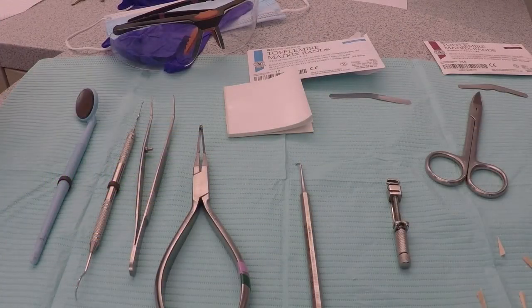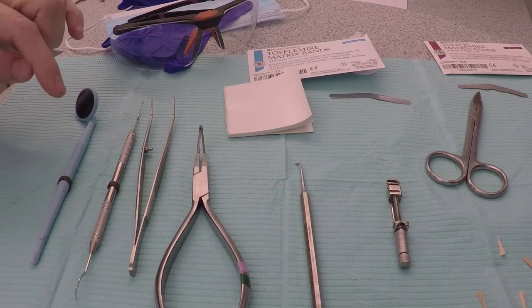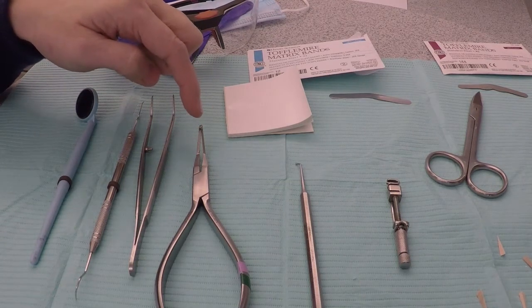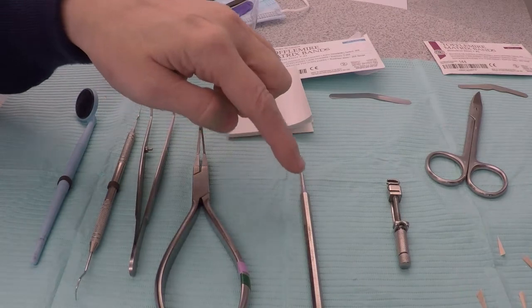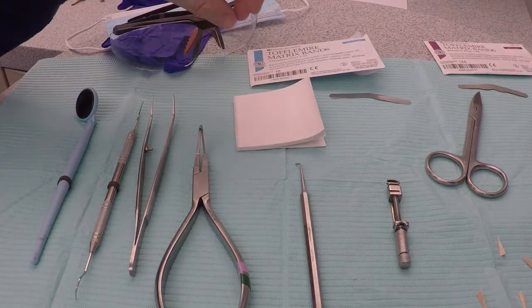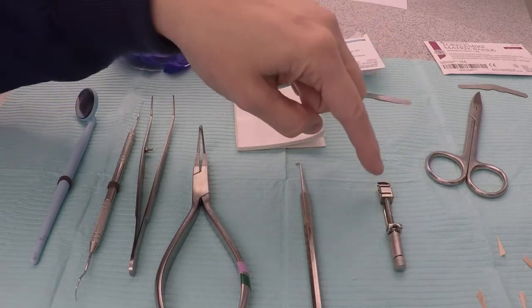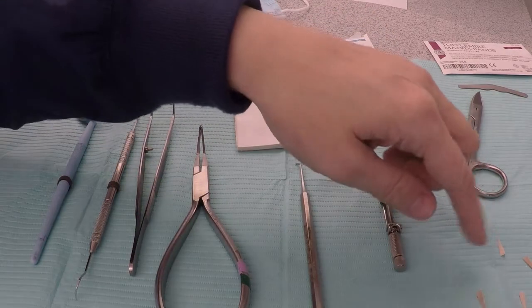Our PPE, a basic setup, a 110 pliers — also known as the Howe pliers — a ball burnisher with the paper pad, our matrix band, our Toffelmeyer retainer, and an assortment of wedges.